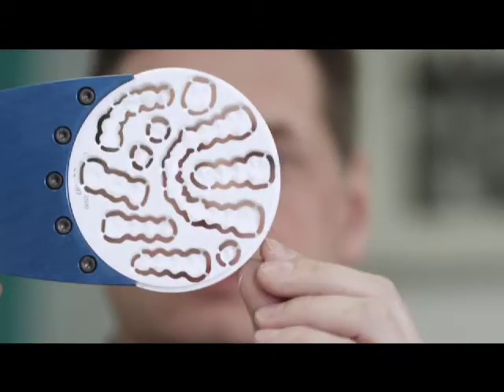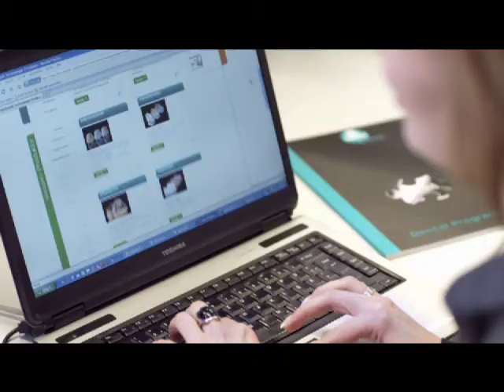With the Shera EcoMill system, also smaller laboratories are able to participate in the modern CAD/CAM technology in a cost-effective way. You work license-free, you work independently, and with the knowledge that the Shera service team will help with support and advice at any time.